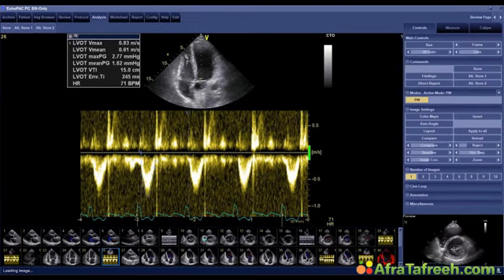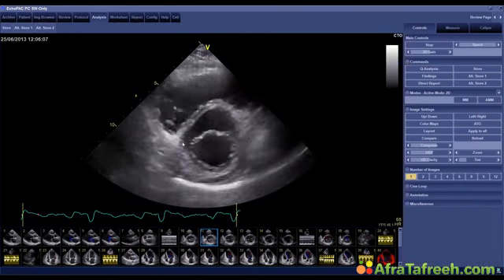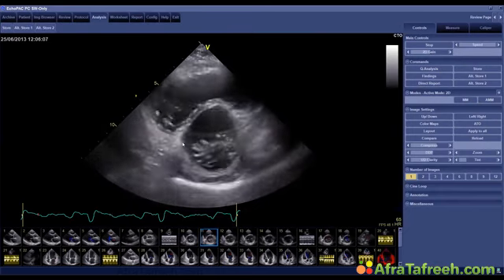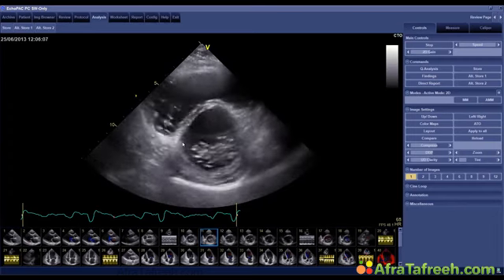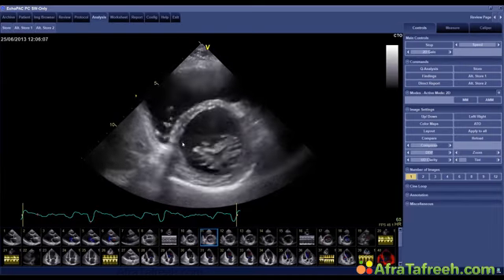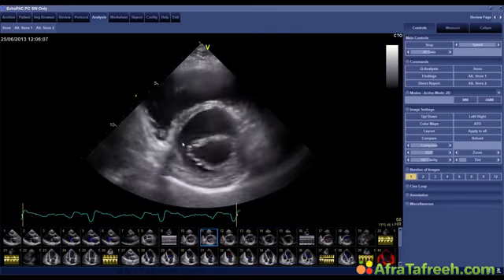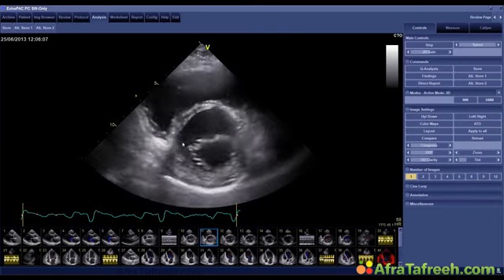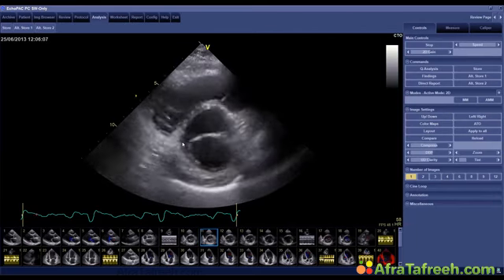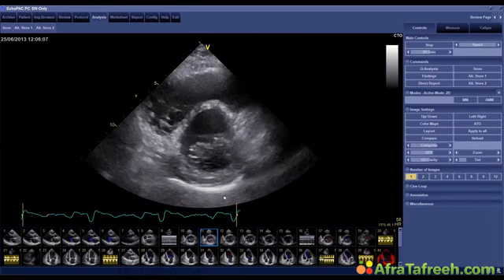So the abnormal septal motion is usually something which you have to take into consideration as being relative between the right and the left. Okay, this is the answer to Gentiana's question. And Marian asked, would you add heart cath? Well, in essence we did, because in every patient with cardiomyopathy, we have to exclude coronary artery disease, and this is what we did, and he had a completely normal coronary angiogram with everything okay. Okay, and Carolina and Dana said this was annular dilatation, which I completely agree with.